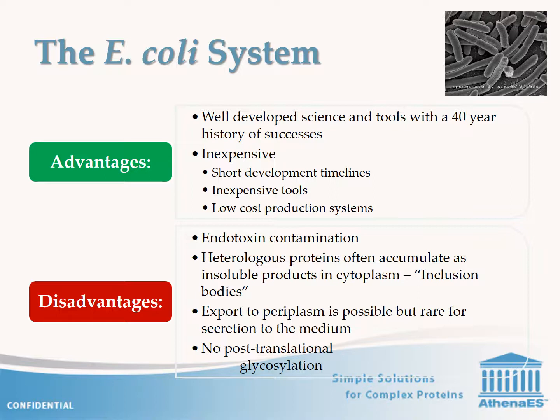Protein preparations can be contaminated with endotoxin, residual pieces of the lipopolysaccharide that compose the outer matrix of the bacterium that have pyrogenic properties. Care must be taken in removing endotoxin before performing any animal or human studies, as well as for certain cell-based assays.